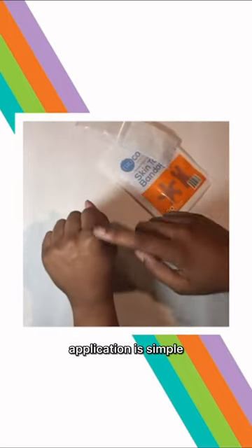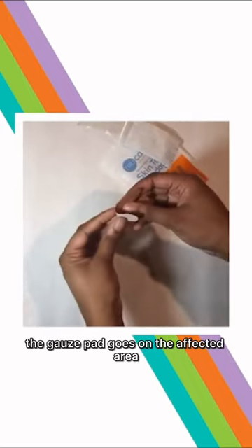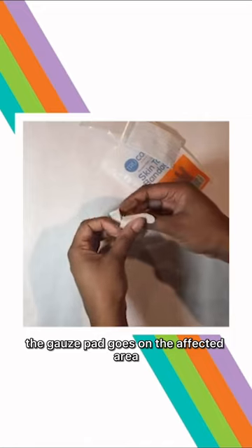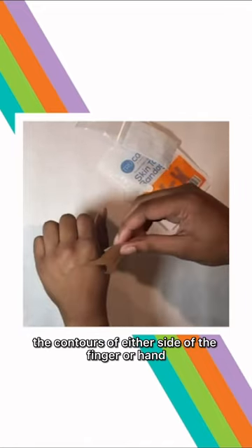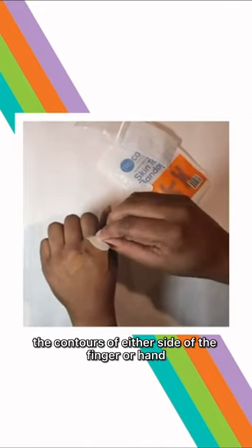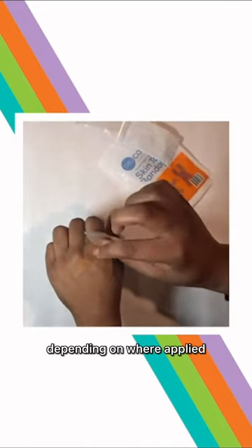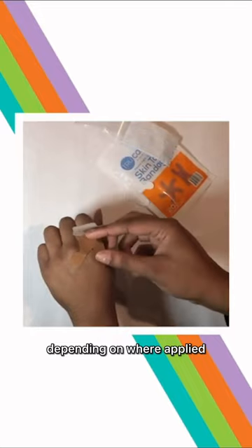Application is simple. The gauze pad goes on the affected area. The wings make it stretch the contour of either side of the finger or hand, depending on where applied.